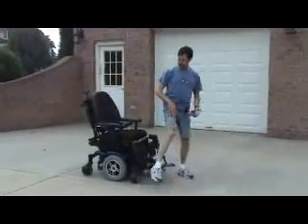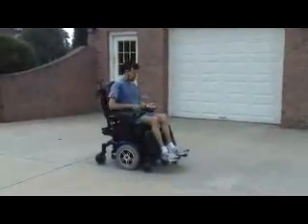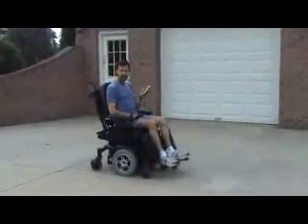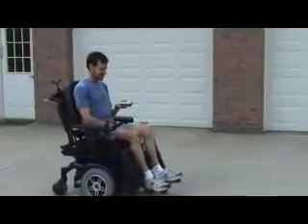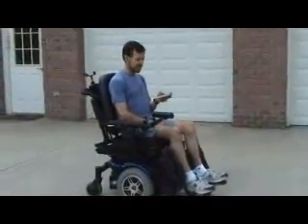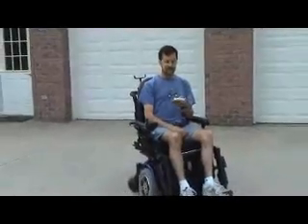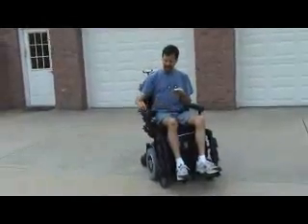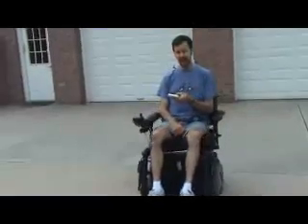I'll sit down here and show you what we can do. My handy dandy keypad — press the button and off we go. I'm going to hit the button to turn, turning towards the left. Speed her up a little bit, go slow to make sure we don't get into trouble.